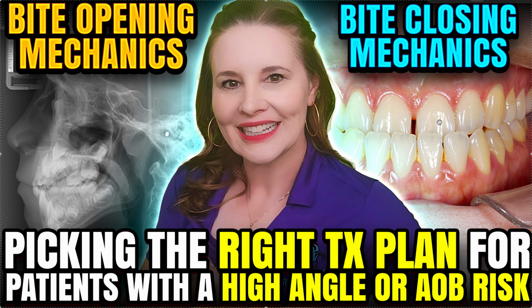So in general, if you had to put things in buckets, braces and elastics open a bite, aligners, anything that covers the tops of the teeth, close a bite. Removing tooth structure through extractions or IPR closes a bite. Moving things out or forward opens a bite. So just keep that in mind when you're picking your treatment plan, especially if you have a patient with either a severe low angle or a severe high angle, so that you don't sway things in the wrong direction, because once you take it to that point of no return, there's no way you're going to be able to fix this. So you want to kind of just keep things under control as much as possible.